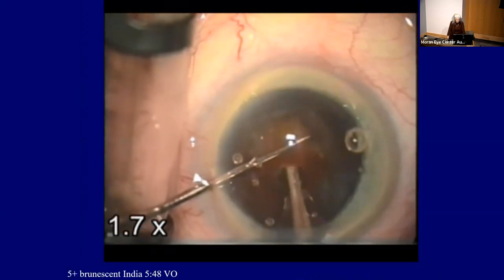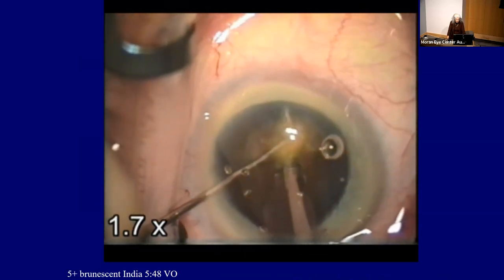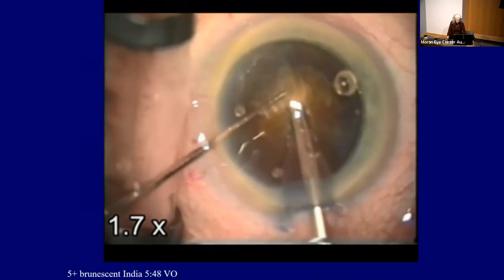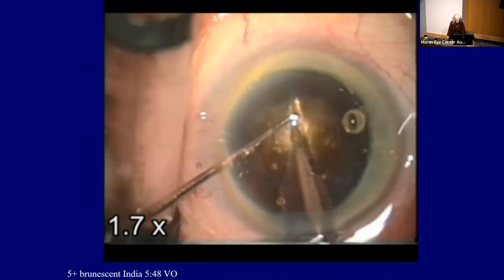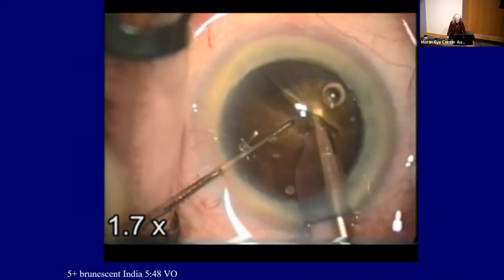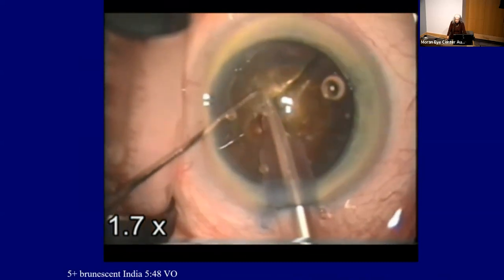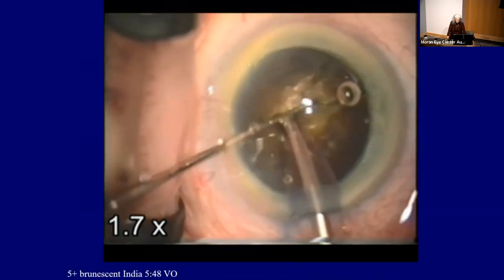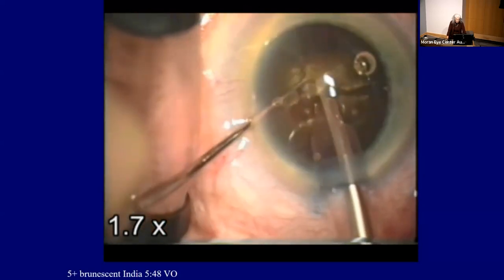So here's a reasonably brunescent lens. And most all my videos are sped up here, for the sake of time. It does take extra time; where I'm maybe an 8 to 12 minute phaco time, this will be a 15 to 20 minute phaco time on a super brunescent lens. And you can see the bubble up there in the endothelial protective layer. And it's kind of a barometer that shows me that my endothelium is really safe.